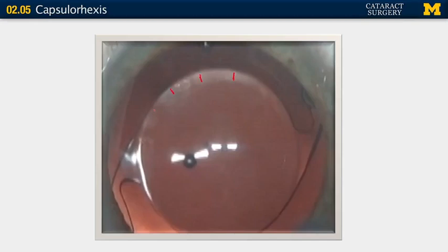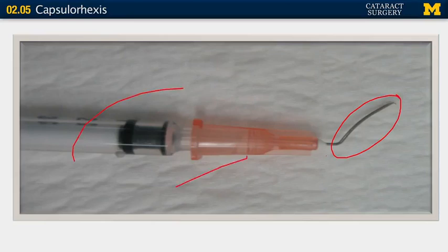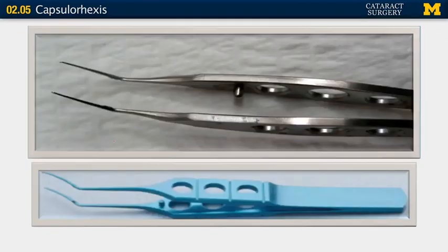There are many different techniques and tools for creating this opening. Most people use a cystotome for at least part of the capsulorhexis — mounted on a metal handle or a TB syringe. Some folks do the entire capsulorhexis with a bent needle cystotome and never use capsular forceps. I use a Utrata, but there are other brands. Some surgeons use the tip of lens forceps to make the first opening in the capsule, drag to create a flap, and go all the way around.